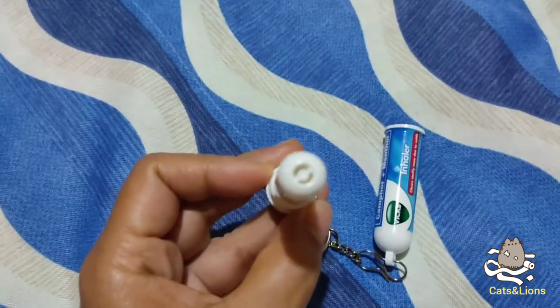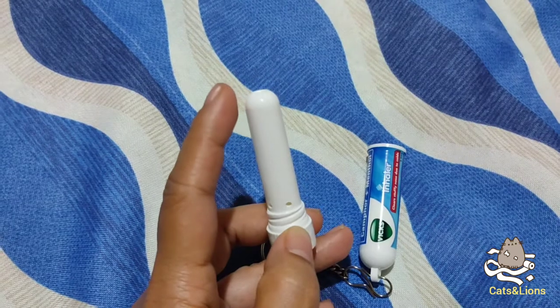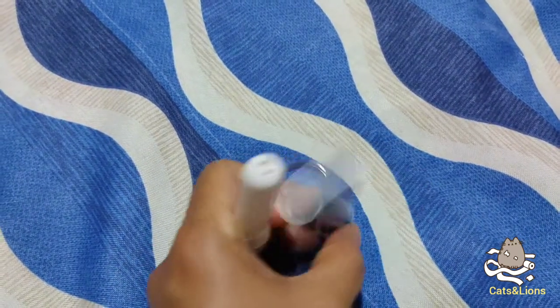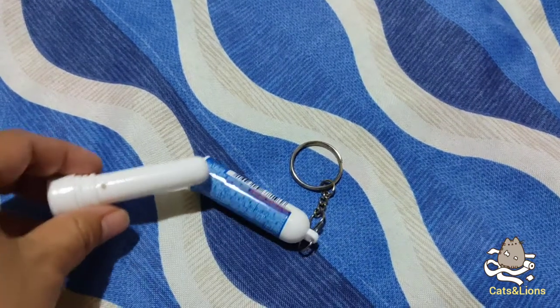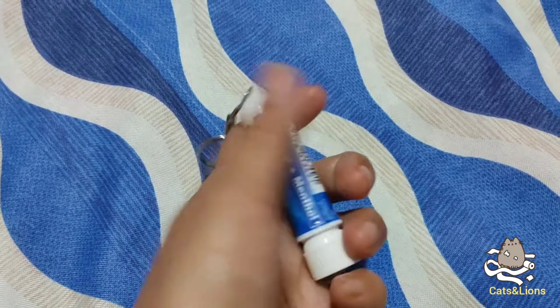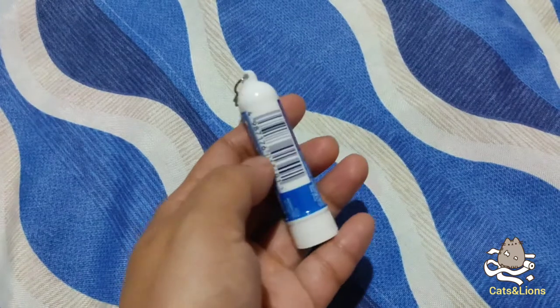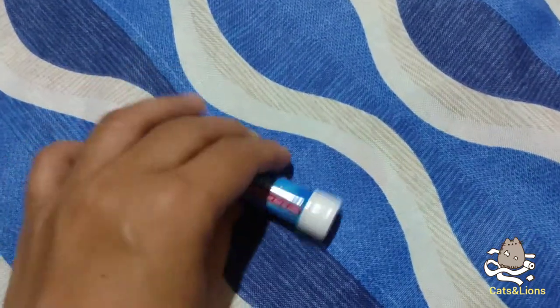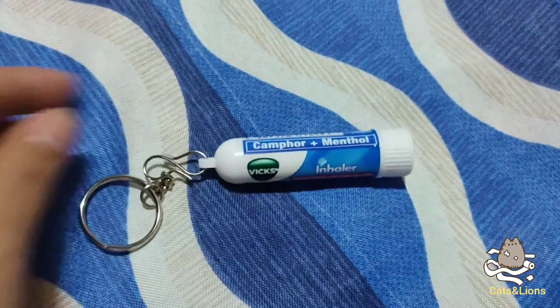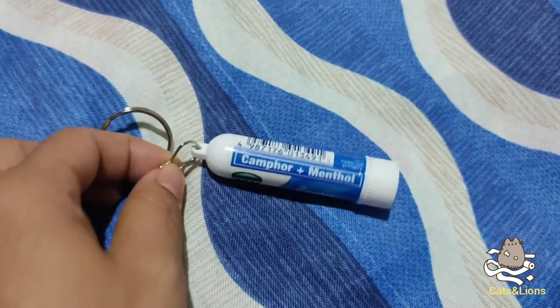You put this over your nostril and then inhale it. This is a really portable package that you can transport anywhere. The tube is actually made of plastic, and it comes in this keychain format so you could just attach it to your bag.